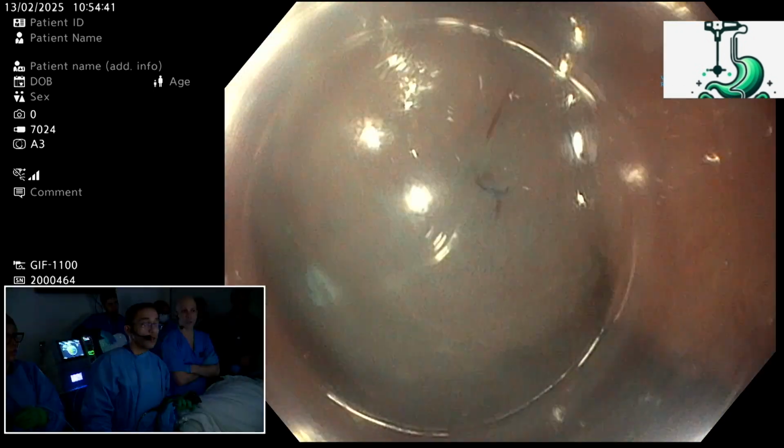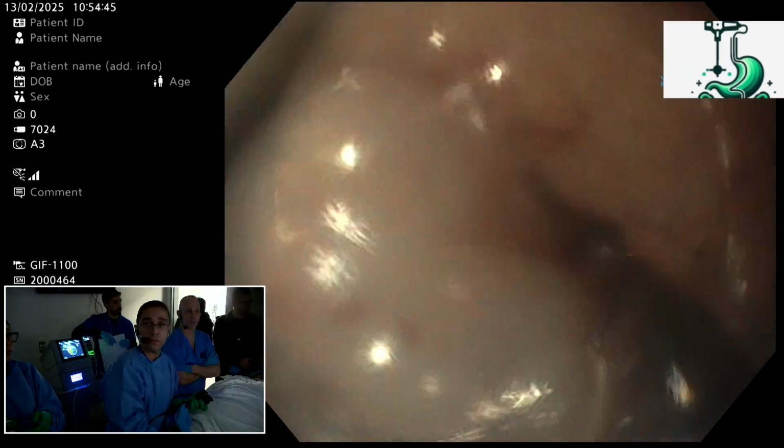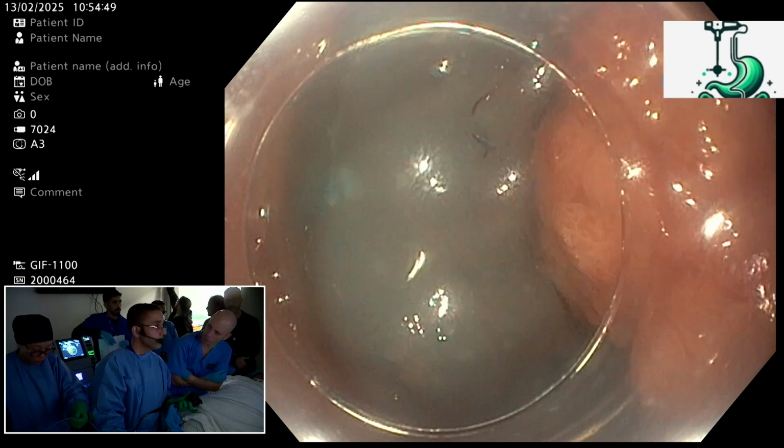Yes, thank you. So we have already injected the polyp and raised the polyp. What have we used for the injection?